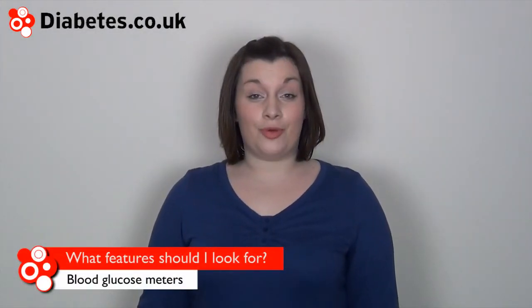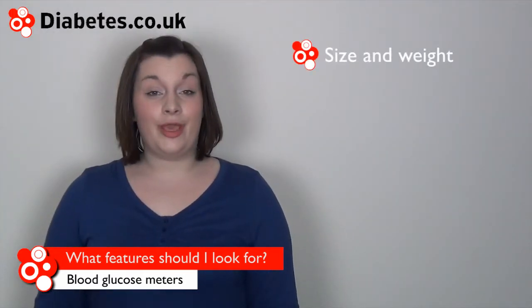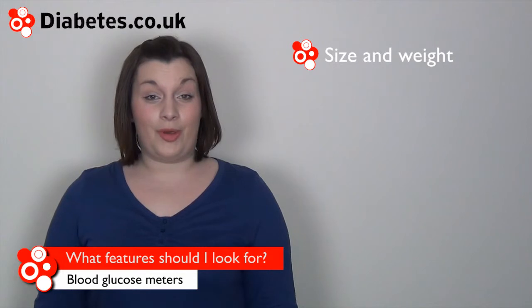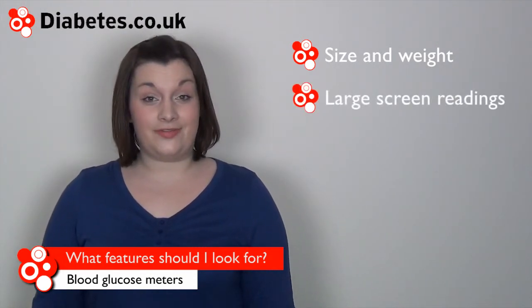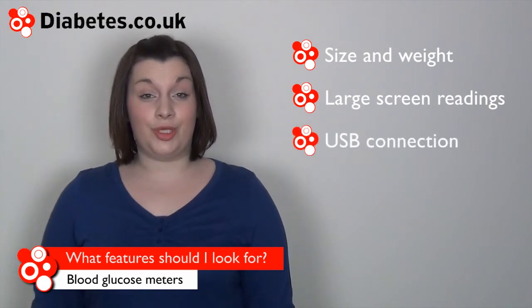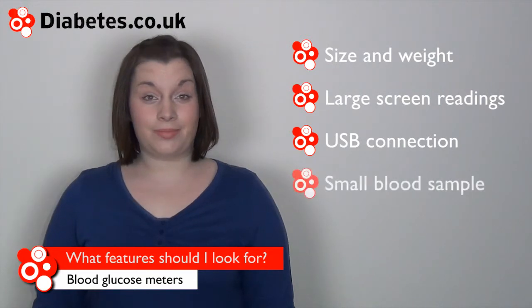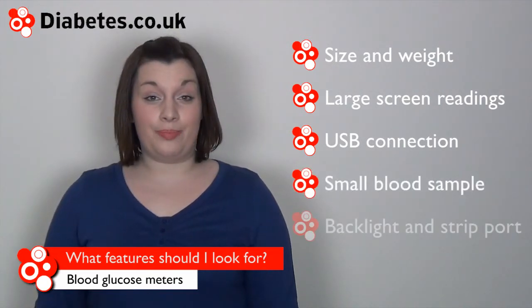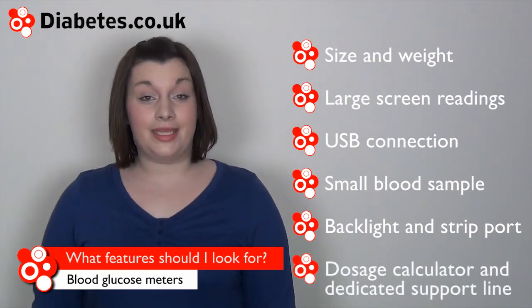Useful properties to look out for include size and weight — people on the go may prefer a meter that can fit into their pocket — large screen readings if you have sight difficulties, easy USB connection to a computer, small droplet of blood needed, backlight and strip port for testing in the dark, and insulin dosing calculators.